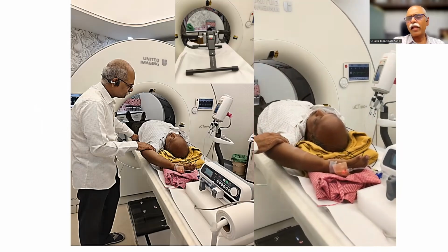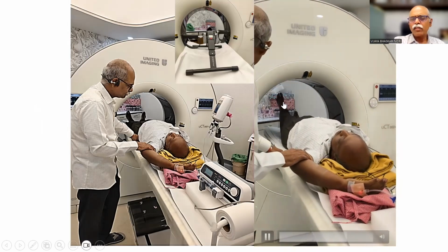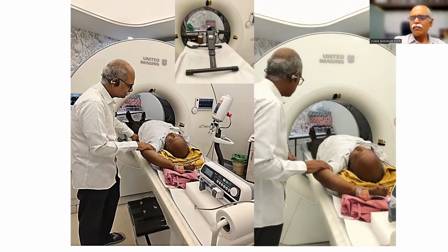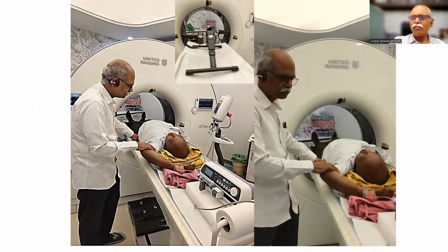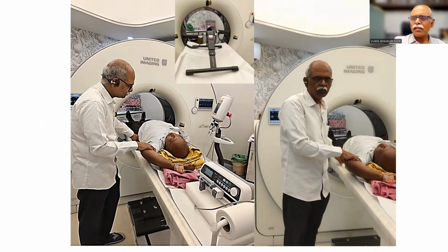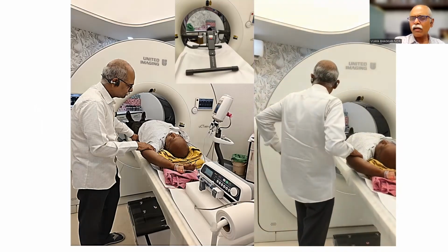The exercise I ask is limb elevation. Within the 3 minutes, ask him to do limb elevation, alternating each limb. This has two effects. One, peripheral vasodilatation and pooling of blood will be reduced, and the blood coming to the heart, the cardiac output, will be improved.